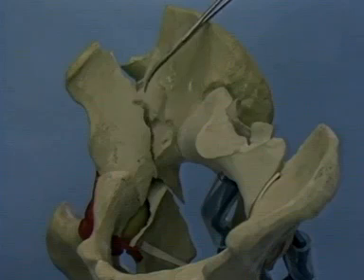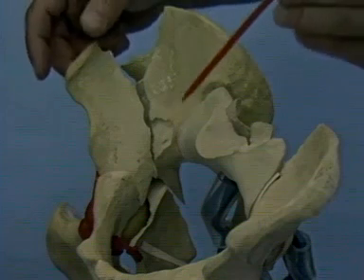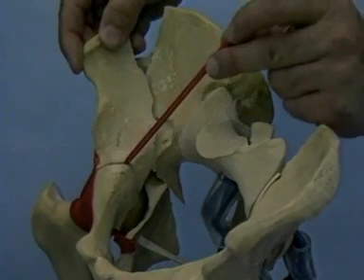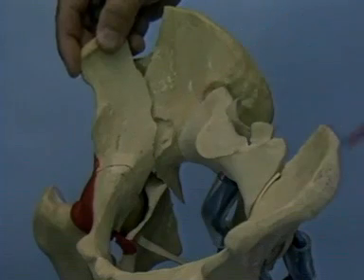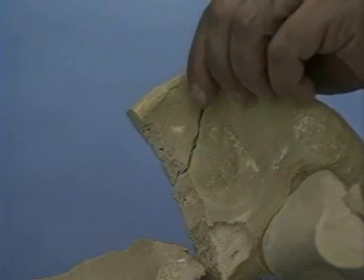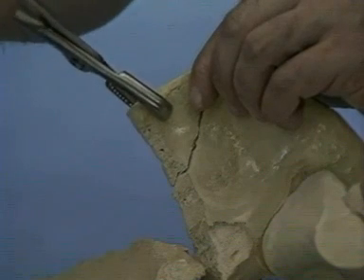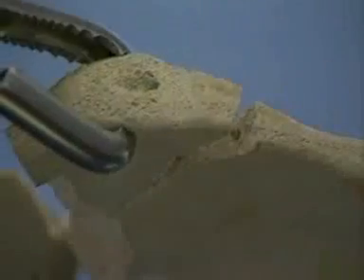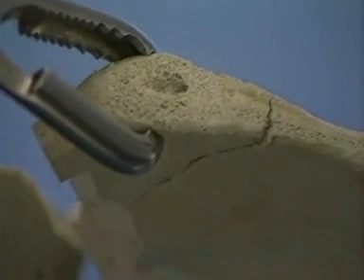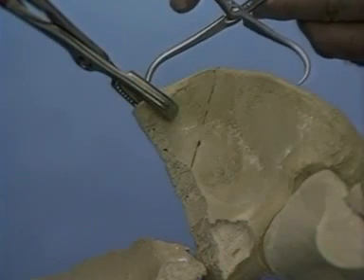A free fragment is detached from the pelvic brim. There is a secondary fracture of the anterior column at the level of the pectineal eminence. The triangular segment of the iliac wing is reduced into place with a Farabeuf clamp, and the reduction is held with the pointed reduction forceps.